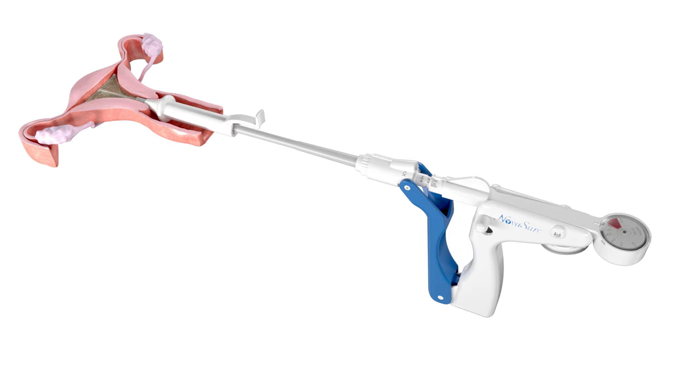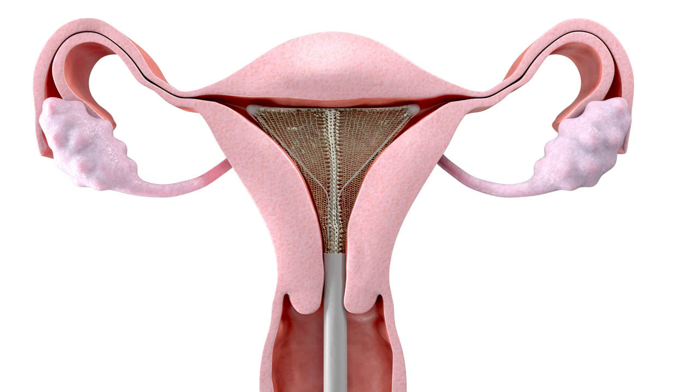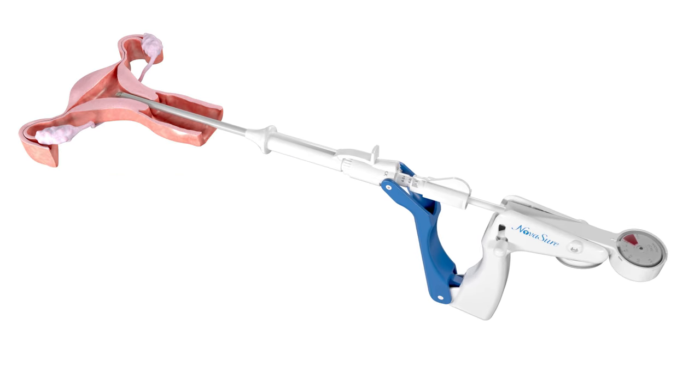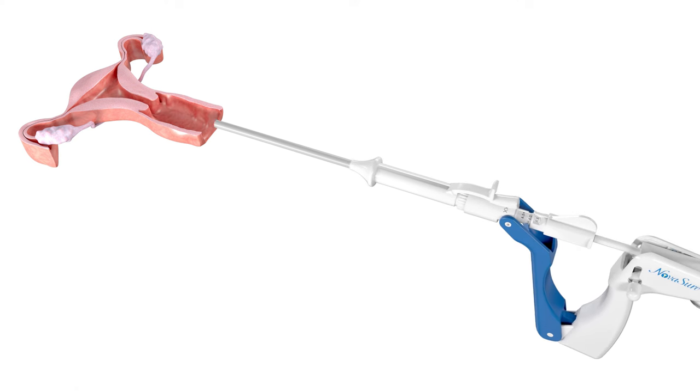fully retract the cervical collar by using the tab on the cervical collar and unlock the disposable device by pressing the lock release button. Close the disposable device by holding the front handle stationary and gently pulling the rear handle backwards until the array has been retracted into the sheath and the disposable device can be removed from the patient.